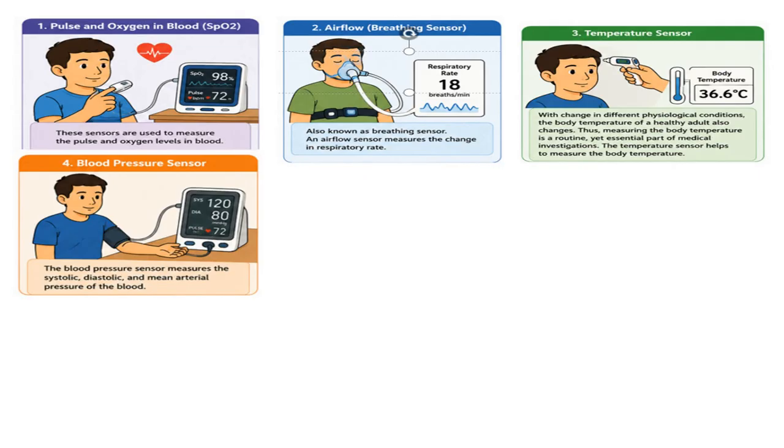In healthcare IoT systems, wearable blood pressure monitors continuously track a patient's blood pressure and transmit the data to healthcare providers. This enables remote monitoring and early detection of abnormal conditions, and regular monitoring helps the doctors evaluate treatment effectiveness and allows patients to manage hypertension or other cardiovascular conditions more effectively.